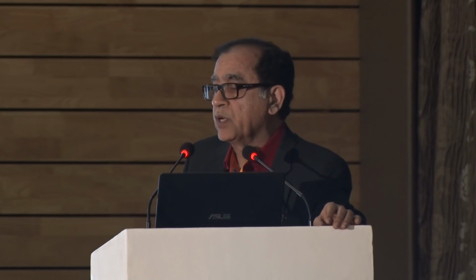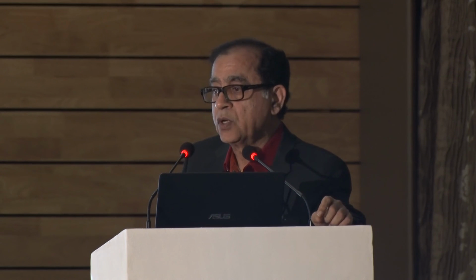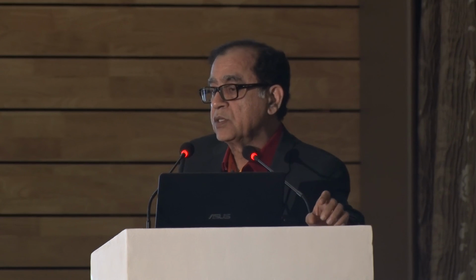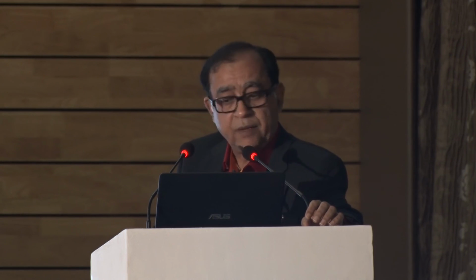And now after putting the lens, I stain with the trypan blue, which is diluted 1:4, and then do the vitrectomy. So if there is no vitreous in the AC, and if your lens is in the bag, actually it will remain centered. It is only if the vitreous tag is attached to the lens or coming to the wound that it may have a problem. So the patient luckily had an excellent outcome.